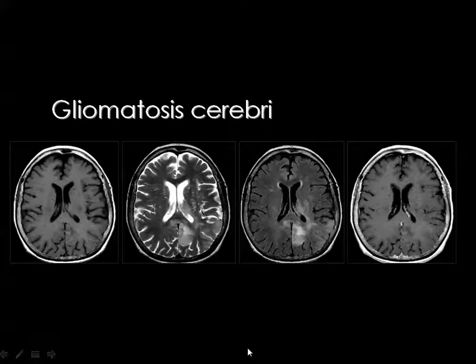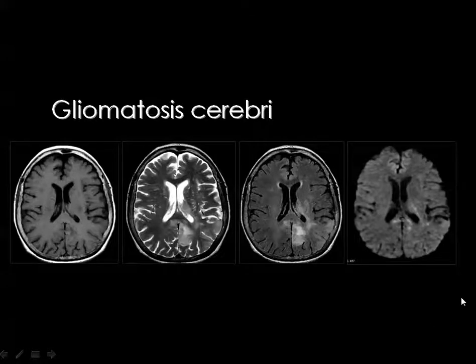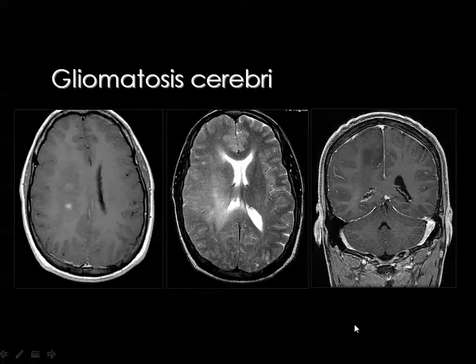And you remember this example, I showed it to you this morning, and the lesion is not seen in the T1, but seen in the T2 and the FLAIR, and after contrast it does not enhance, and in the diffusion weighted image, you see some minimal restriction of the diffusion. Also remember this case, and here you cannot see the tumor, only a small focus of enhancement maybe, or this is blood actually. This is T1 without contrast, and this is T2, and after an injection of contrast you do not see any pattern of enhancement.